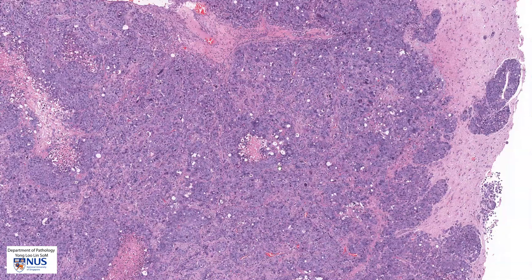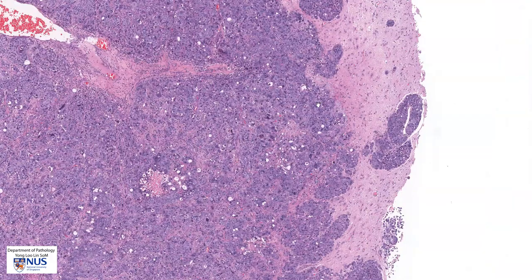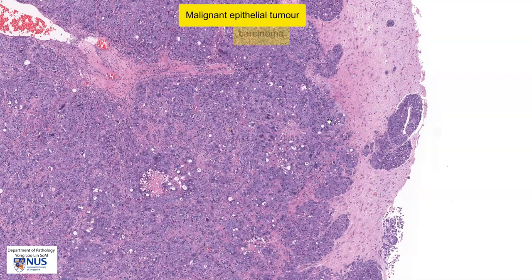So we have the presence of a high-grade tumour which is very cohesive. This cohesive appearance and these large cells are very suggestive of epithelial origin, so this is likely to represent a carcinoma. And because this is located in the brain, therefore, this is likely to represent metastatic carcinoma.